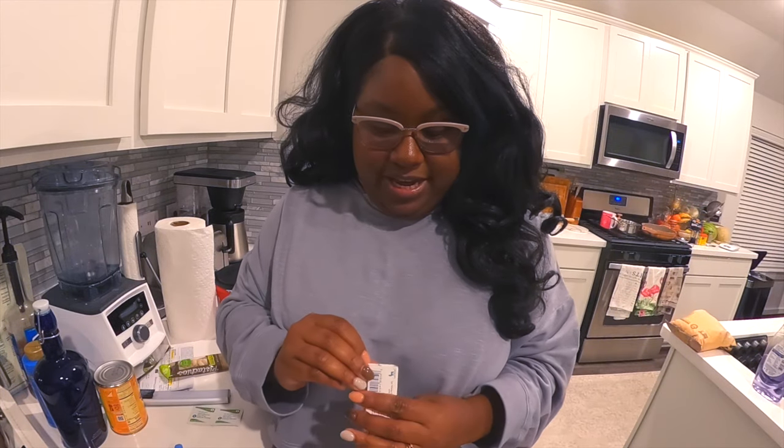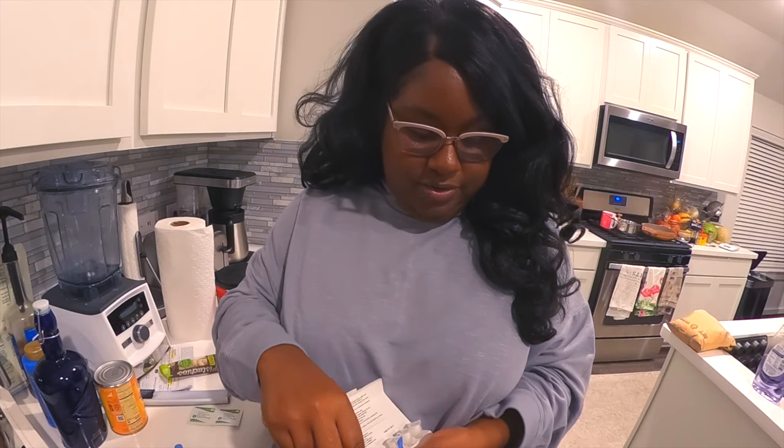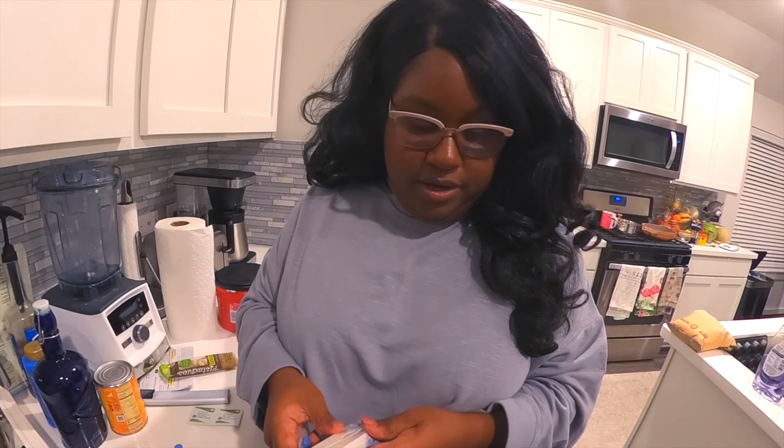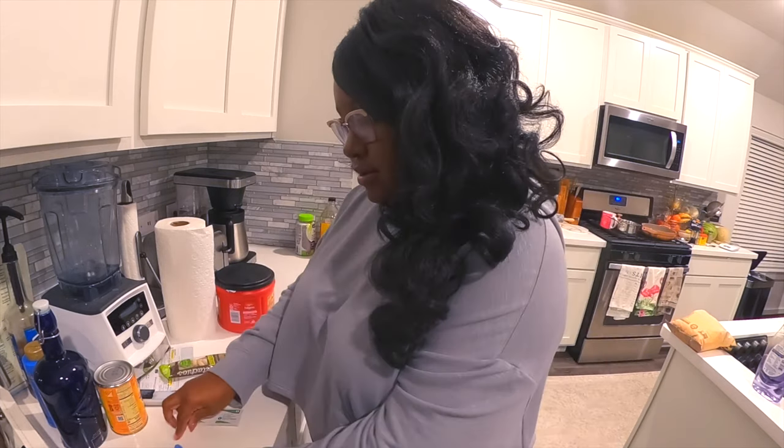I am doing it here in my kitchen because that's just where I do my things — that's where I do insulin, Ozempic, all of that.